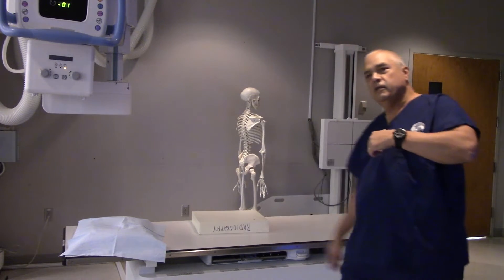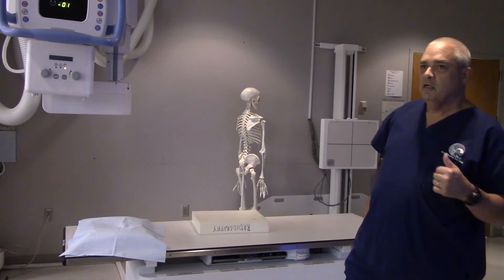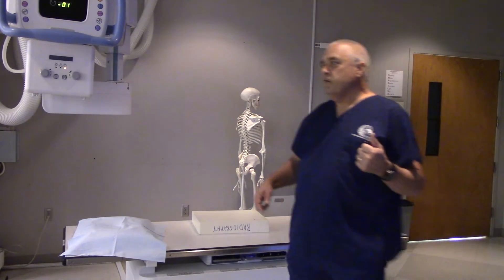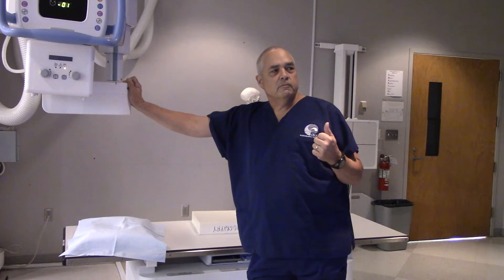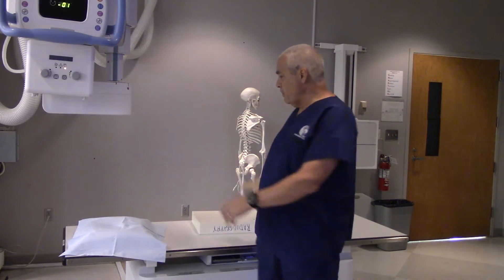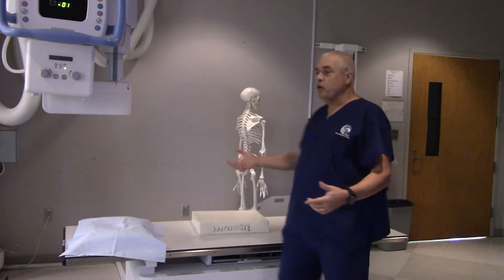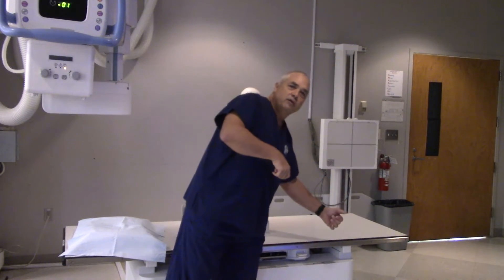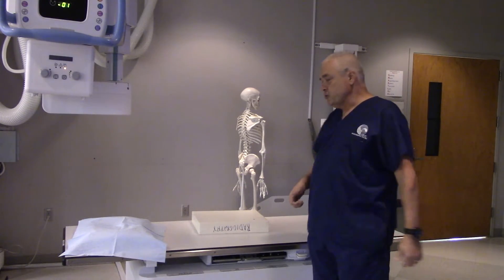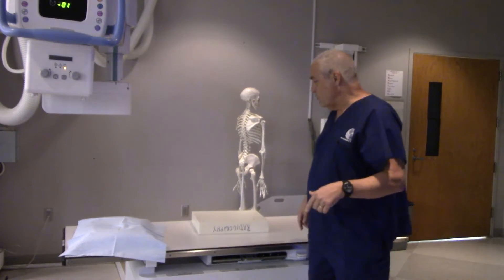Should I do this PA or AP? Because I'm going to have my patient laying recumbent on the table, should they be facing towards me or away from me? It depends on what you're looking for. Here's the truth: it doesn't really matter. So if your patient comes in head first, you can still get them on the table with their left side down and shoot PA. Or if the patient's brought in feet first, then we can lay them this way and shoot AP. Either way, it doesn't matter as long as your image is properly marked. No need to take the stretcher back out and swing it around — just do it the quickest and most efficient way.